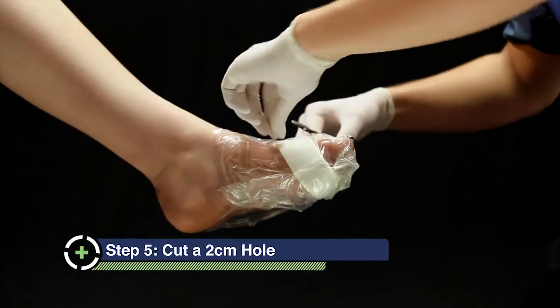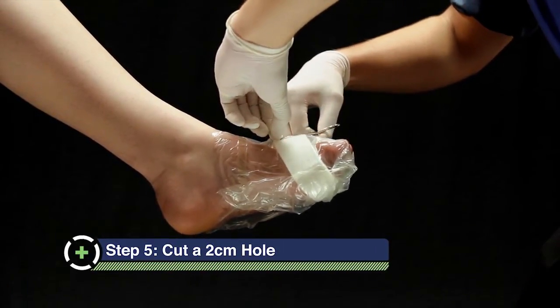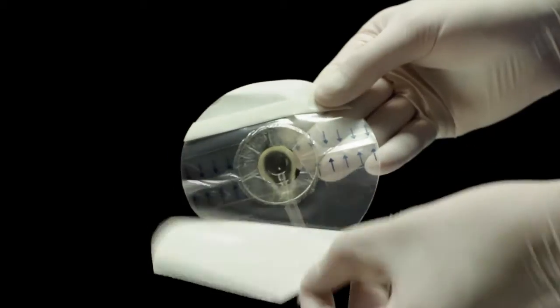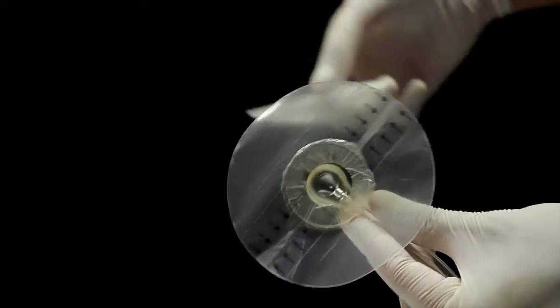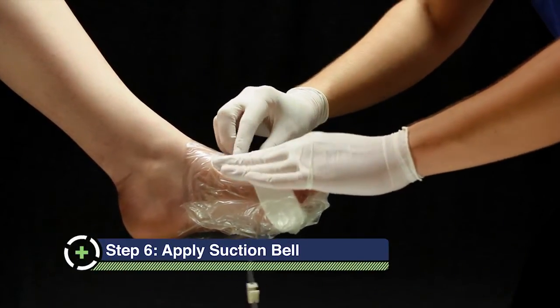Once applied, pinch a section of the film drape on top of the foot over the dressing pad. Cut a 2 cm hole in this location. Remove the suction bell from the packaging and remove the backing layers.